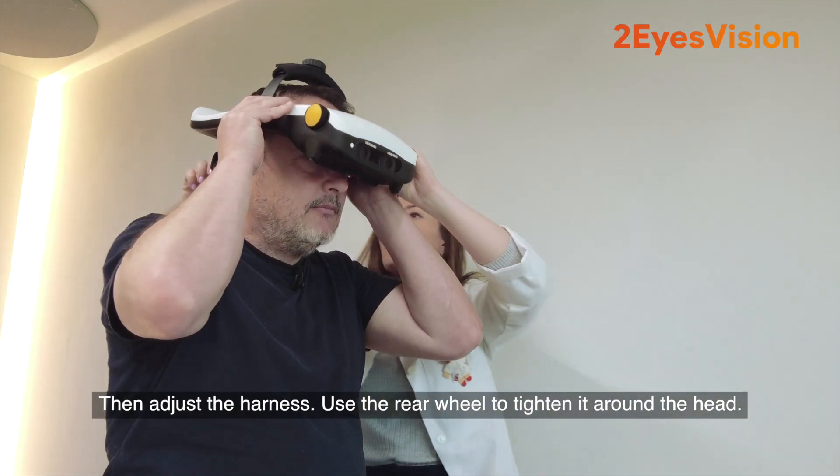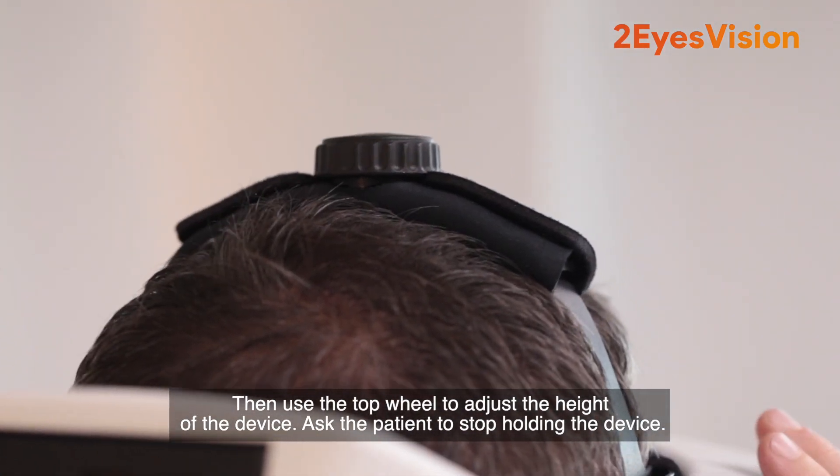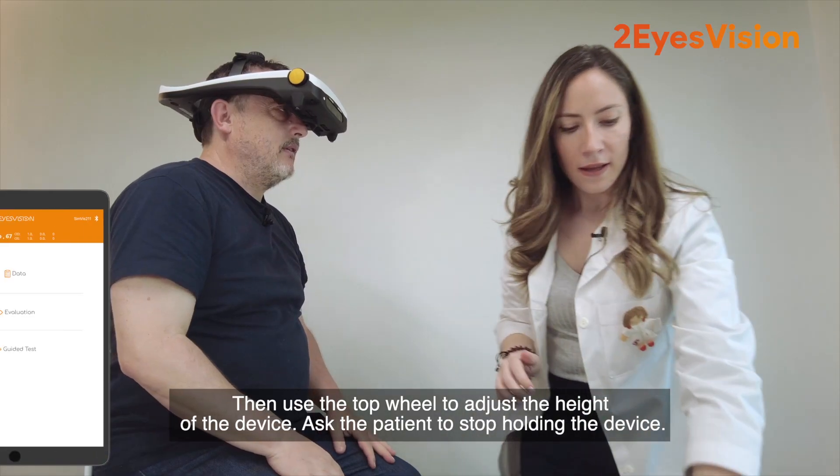Then adjust the harness. Use the rear wheel to tighten it around the head, then use the top wheel to adjust the height of the device.